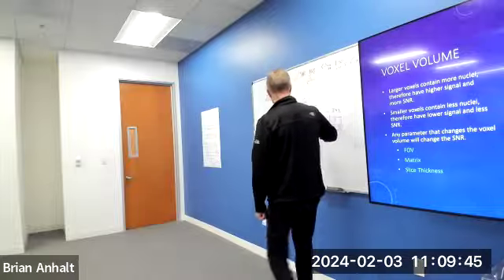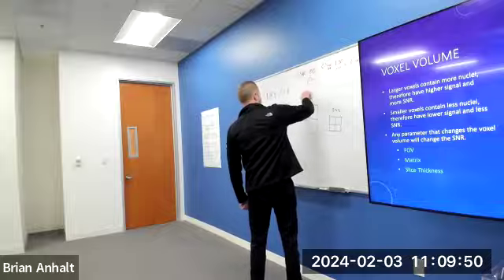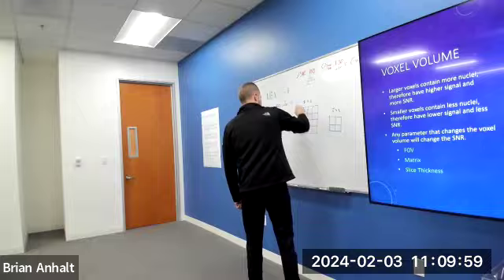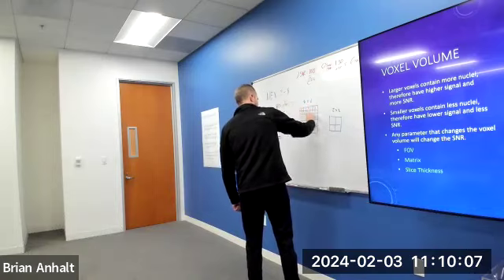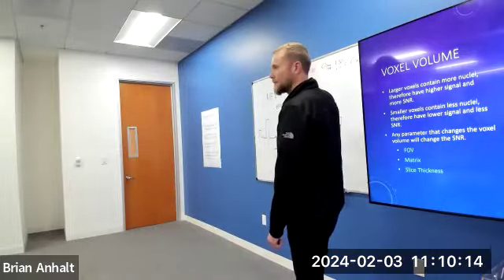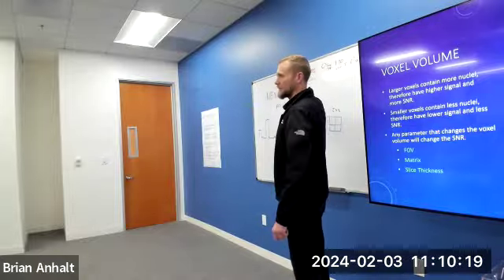What if I did this though? Smaller field of view, finer matrix, coarser matrix, larger field of view, finer matrix.